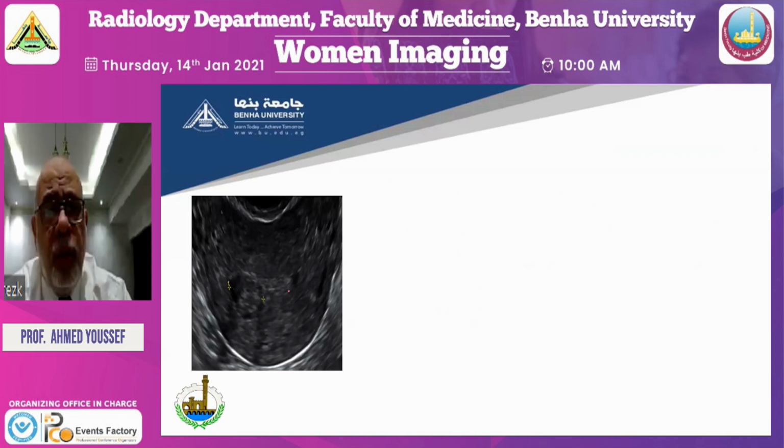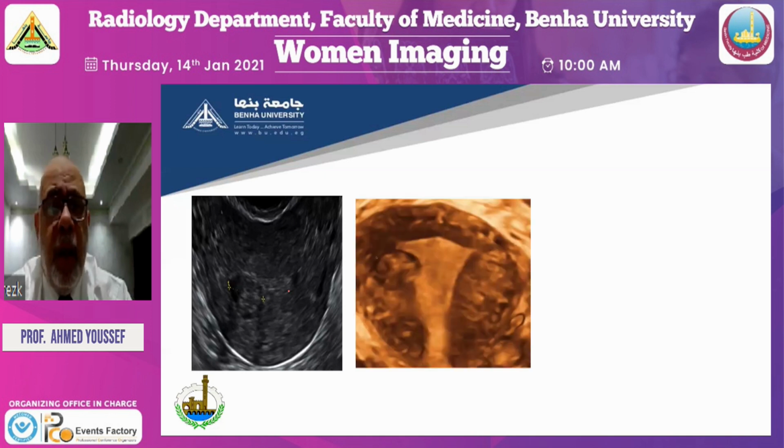But if I go for 3D ultrasound, I will find that the myoma is less than 50%. So it is grade 2. It is the same patient. So it is grade 2 myoma.